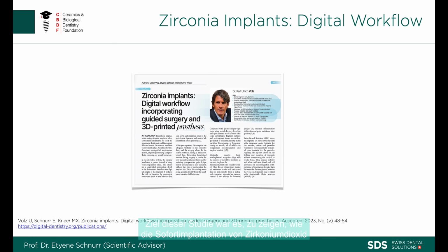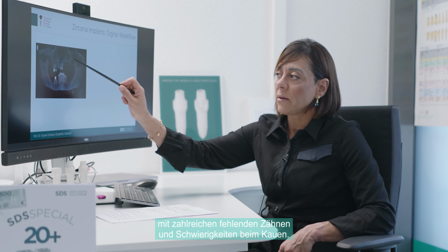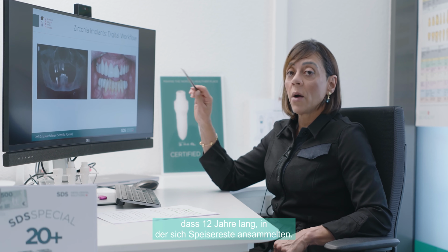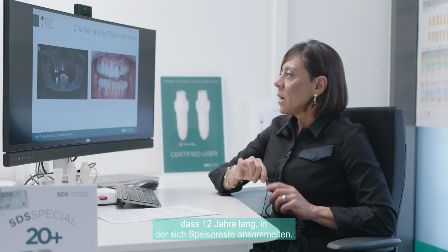The purpose of this study was to show how immediate implantation of Zirconia implants can be incorporated into the digital workflow. A 66-year-old woman presented with numerous missing teeth and chewing difficulties. She had been wearing an unstable prosthesis for 12 years, which accumulated food debris.